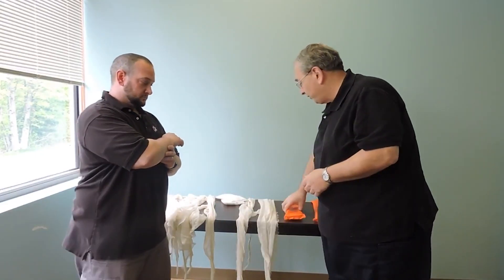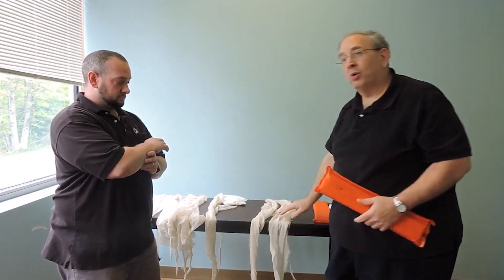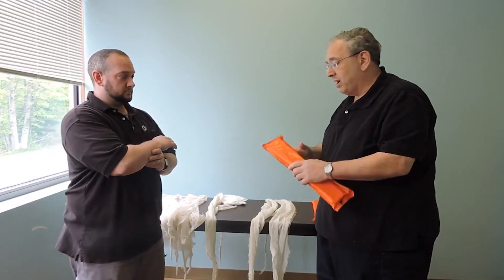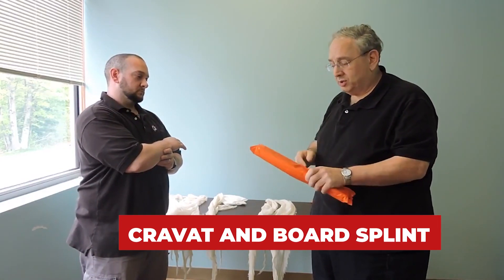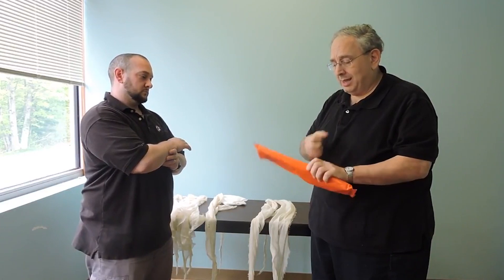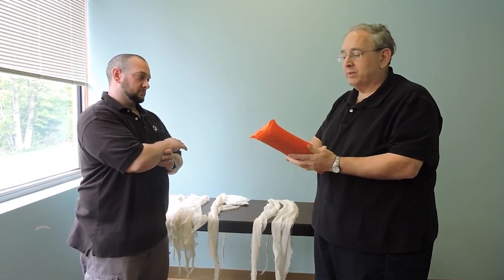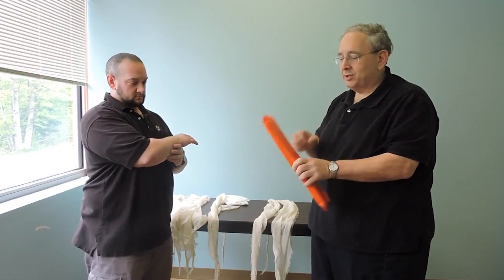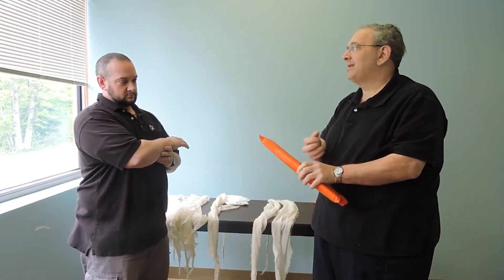For materials, I need three cravats plus two more for the sling and the swath, and I have a board splint. The board splint has two sides: one is padded and the other is hard. You do not want the board side against the patient — you want the padded side against the patient. If you put the board side against the patient, it's an automatic fail on the national exam.